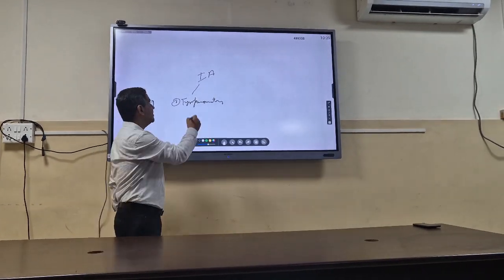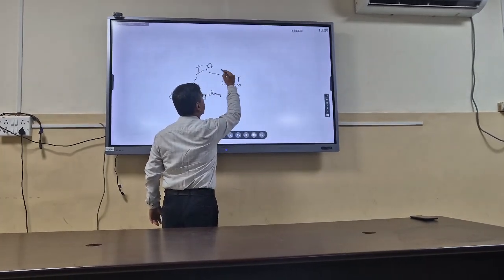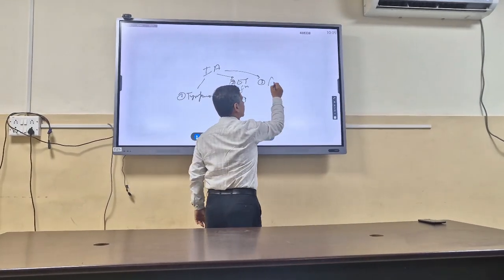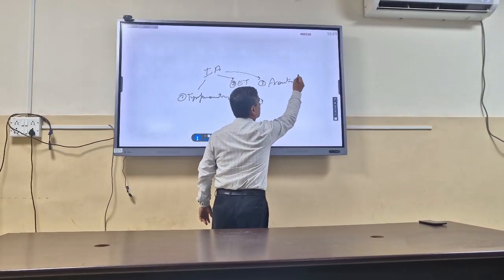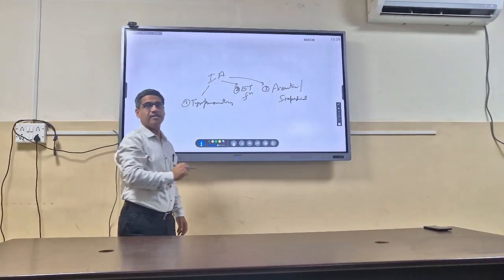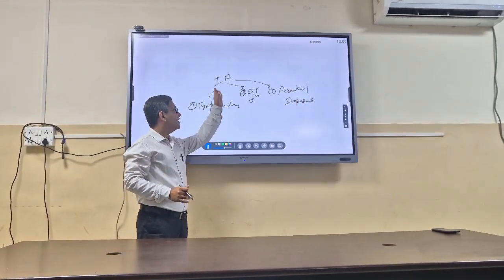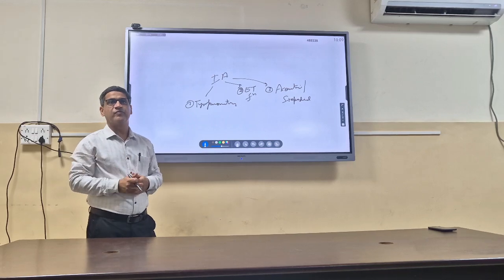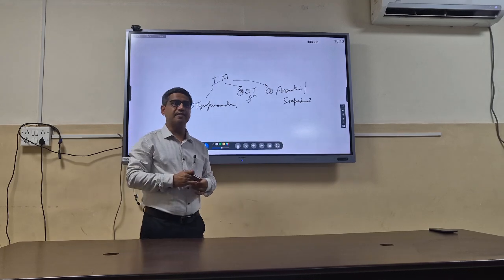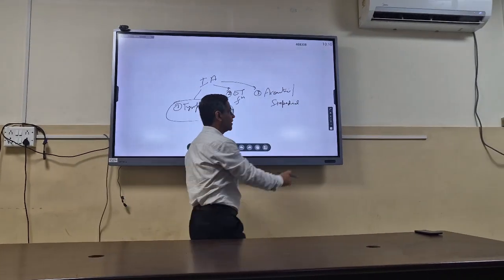One is tympanometry, the second is to check the eustachian tube function, and the third part is the acoustic reflex, or stapedial reflex. When we consider all three together, it is called impedance audiometry. But generally, since long, impedance audiometry and tympanometry are considered the same. The eustachian tube function and acoustic reflex we will discuss some other time, but today I will be dealing primarily with tympanometry. Okay?